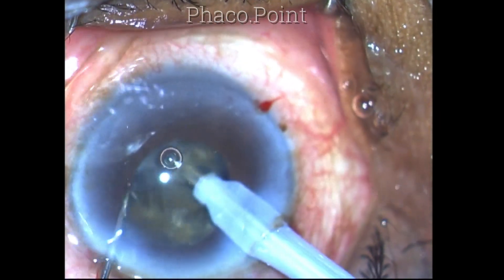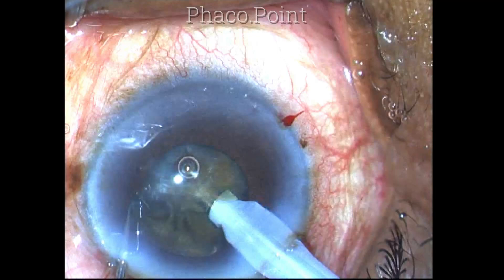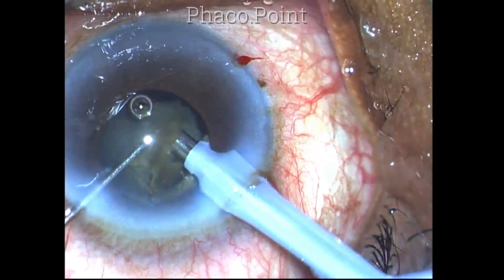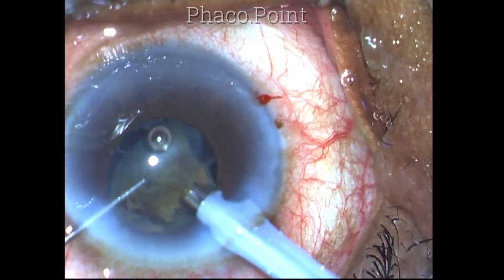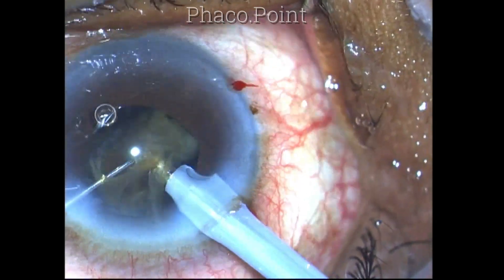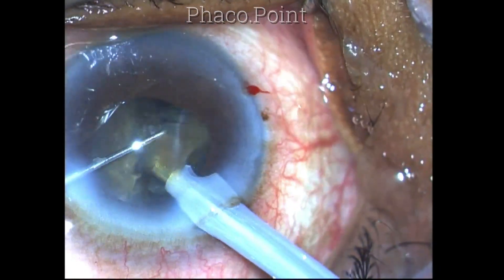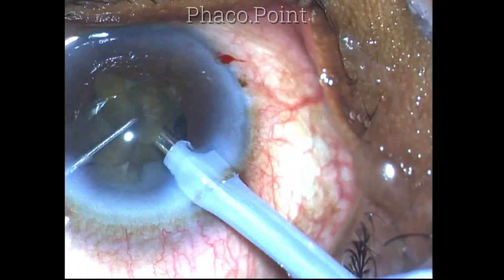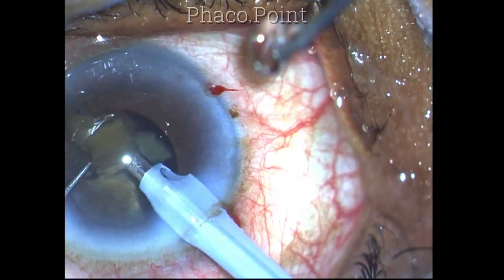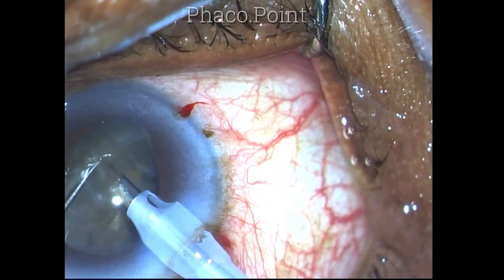Each nucleus fragment is carefully separated. You have to take a firm hold of the nucleus by driving the phaco tip into it with high vacuum. The vacuum used in this case is 350 millimeters of mercury in a Venturi machine. The bottle height is kept at 100 centimeters from the patient's eye. Balanced salt solution is used, not Hartmann's Ringer's lactate solution. Phaco power is activated only after good tip occlusion with the nucleus fragment is achieved, ensuring the phaco energy is delivered into the nucleus.